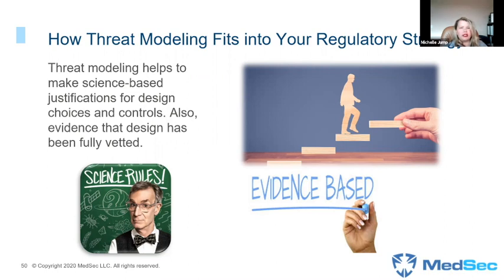The evidence that you can walk through step by step, you go through each of those interfaces, you go through each of these important points, you go through each of the assets. It's a very structured walkthrough of the system so that you feel like you've gone through and really made a good evidence-based assessment of your system.